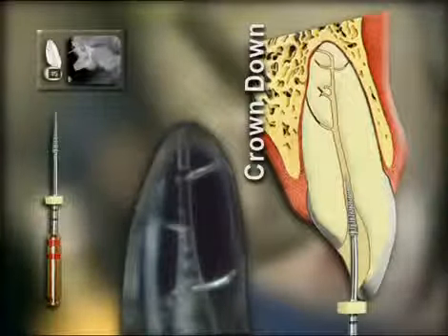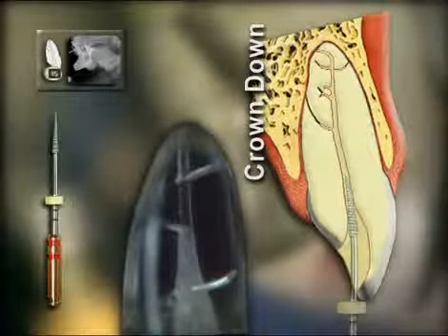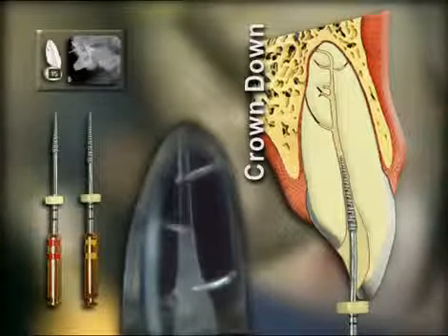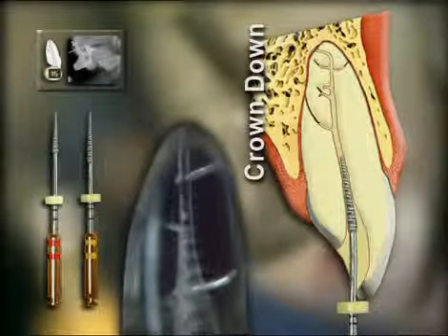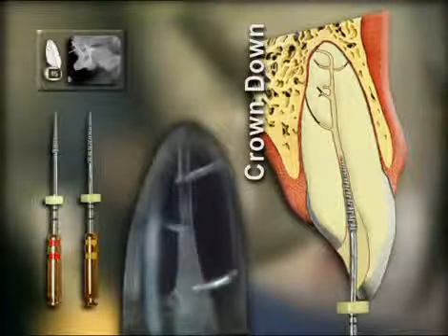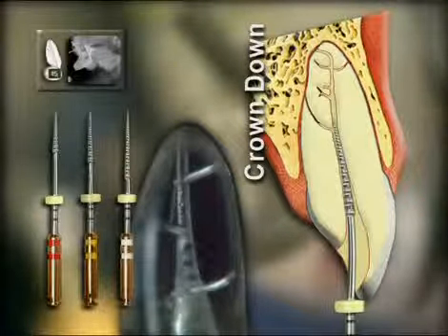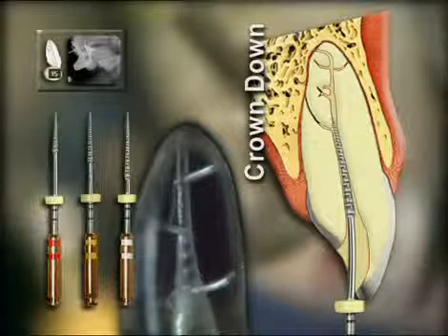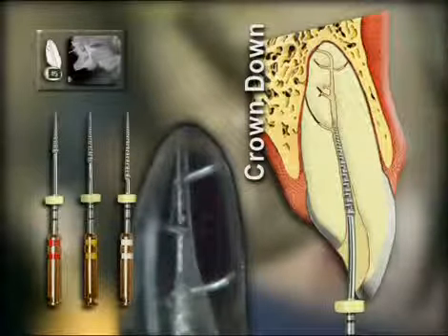Dentin shavings are carried out of the canals, while the guiding tips seek out the canal and prevent apical transportation. These files avoid the risk of over-enlargement in the coronal portions of canals, giving us predefined canal taper. The GT rotary files are used in a crown-down technique, starting with the instrument of the biggest taper, and moving to the instruments with smaller taper. This allows that only a small surface area of the instrument gets in direct contact with the canal walls, thus reducing the risk of fracture or ledging.